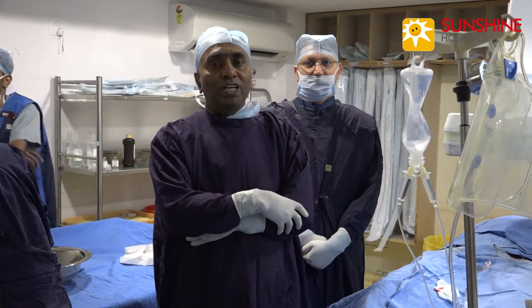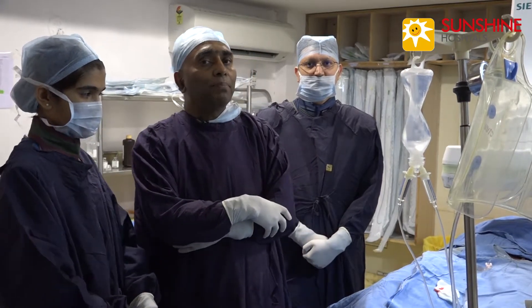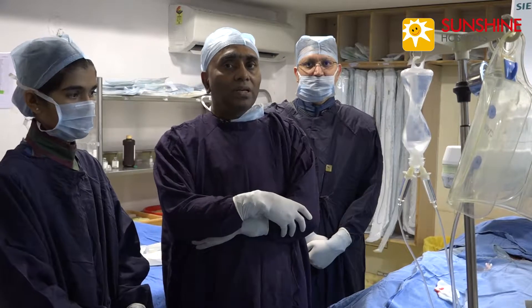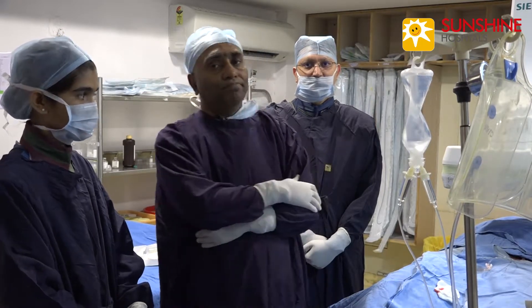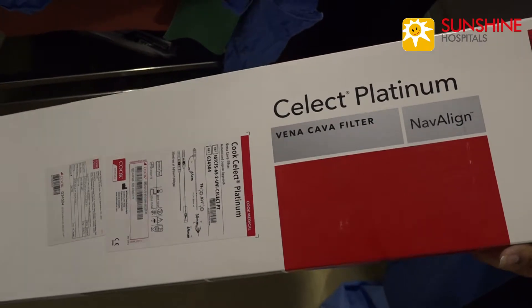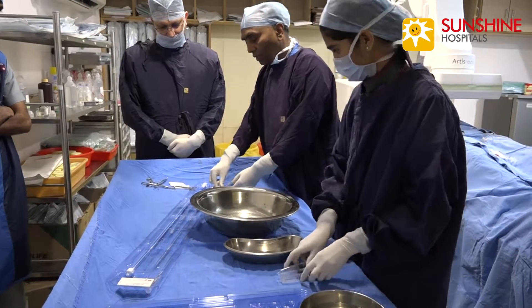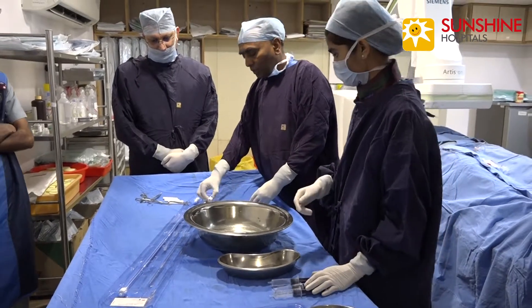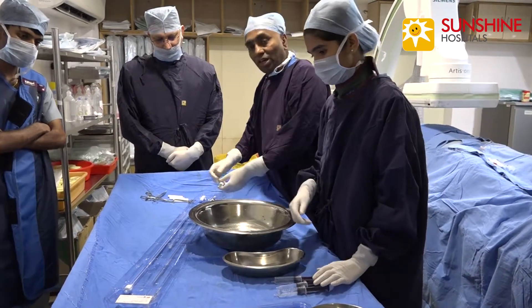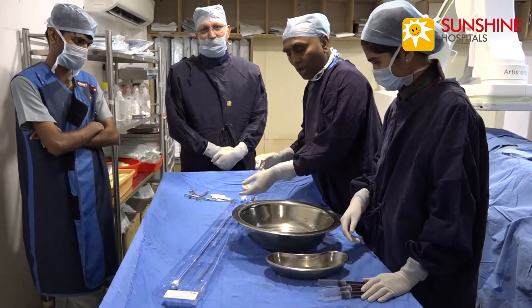This procedure is very simple, almost painless, and the patient is absolutely pain-free and is sleeping. This is called the Select Platinum — the latest IVC filter. It has two access options: one is femoral and one is jugular. Now we are doing this through the femoral one.